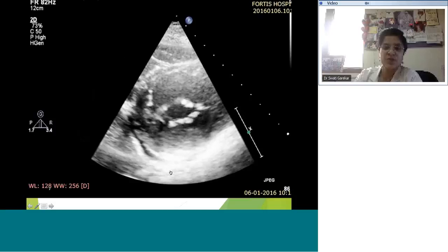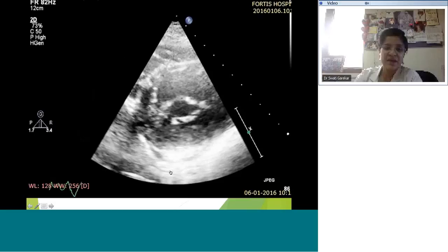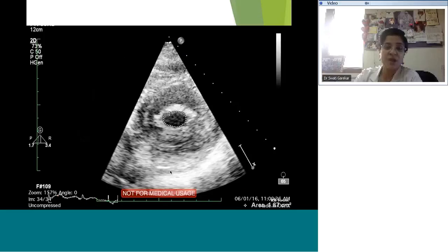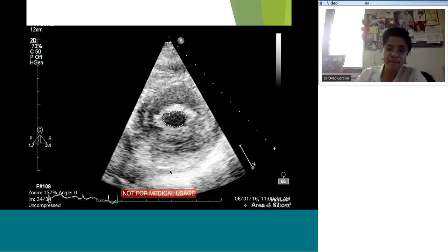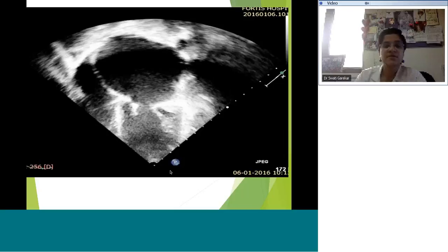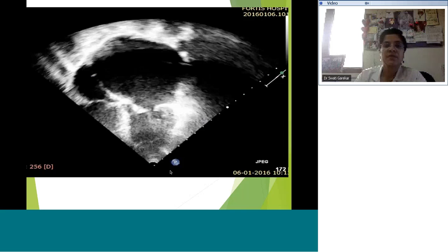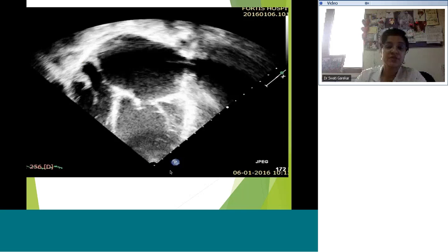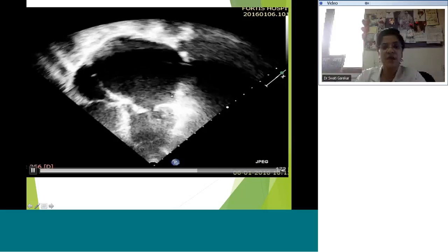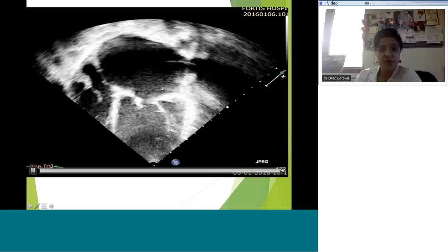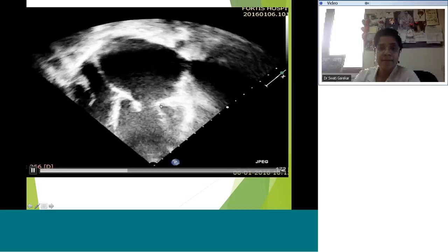In the parasternal short axis view, the orifice area appears smaller. You can trace it out and get an area number to plug into the table to determine mild, moderate, or severe stenosis. In the four chamber view — typical rheumatic mitral affliction — you see a humorously dilated left atrium. Also look out for spontaneous echo contrast in the left atrium.